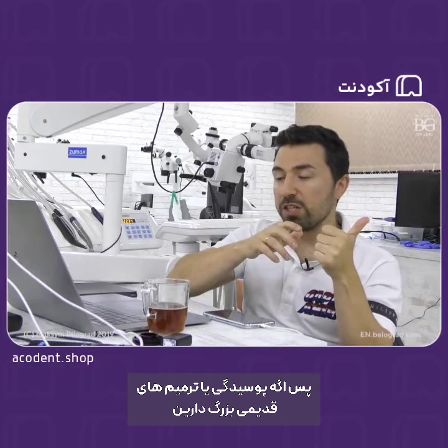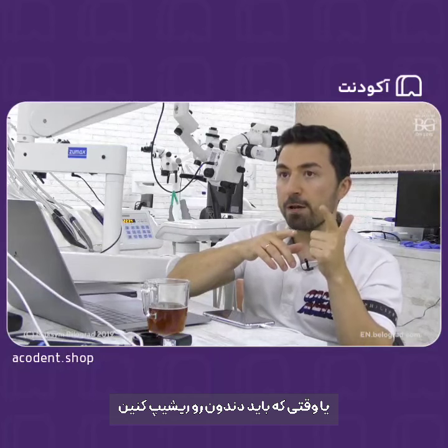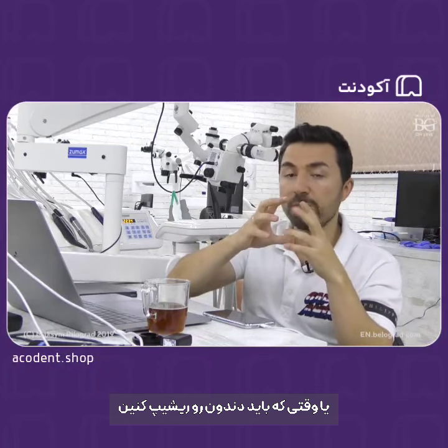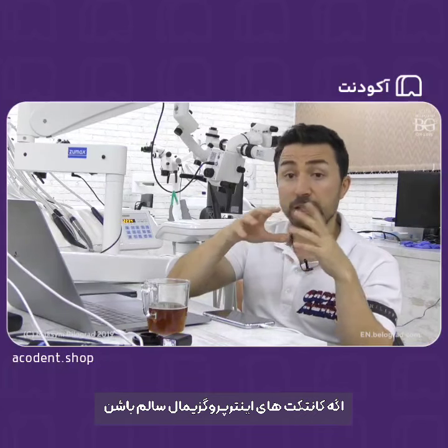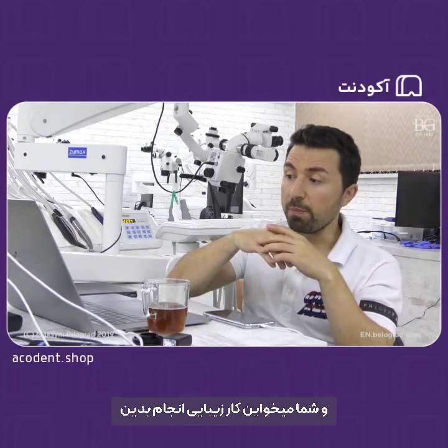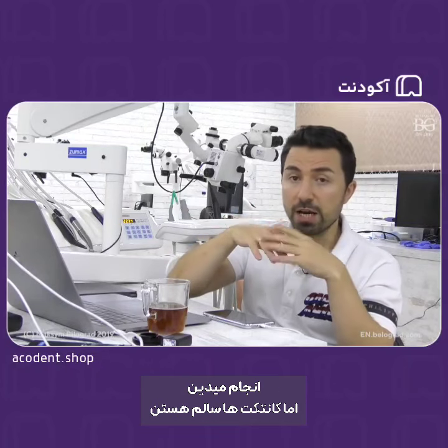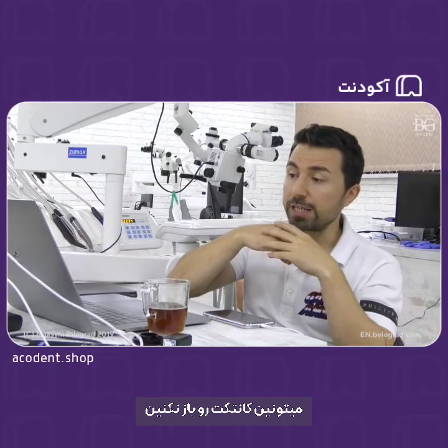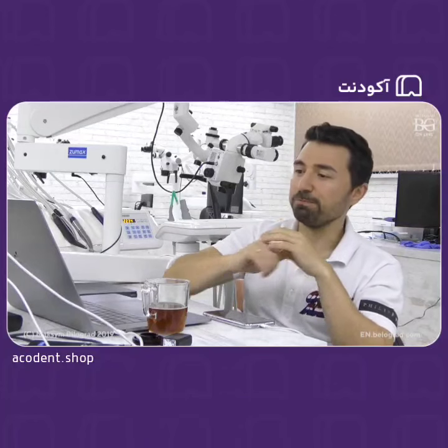So when you have caries defects or big fillings, and when you need to resize, reshape the tooth, I think you open interproximal contacts. If interproximal contacts are intact and you just do an aesthetic rehab or even a full mouth rehab, but again the interproximal contacts are intact, we can keep these interproximal contacts intact and performed by native tooth structures.